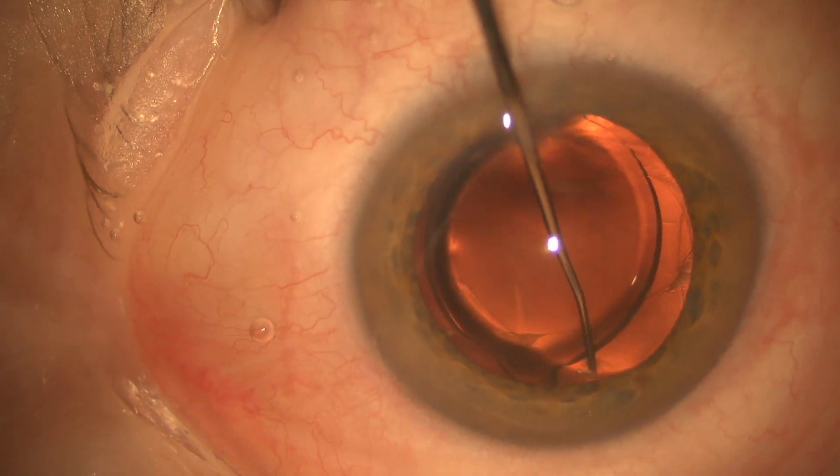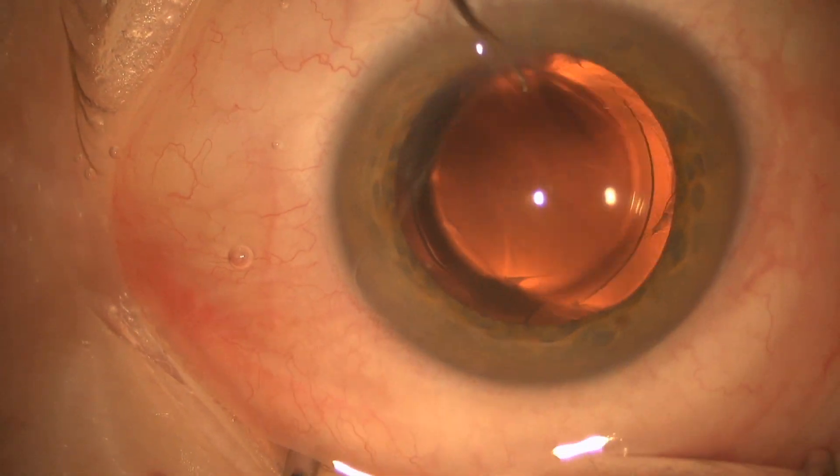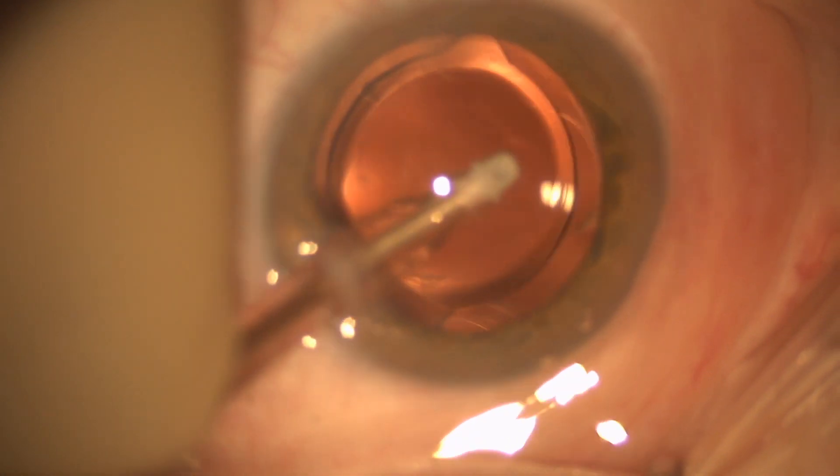Here you can see that we basically have the lens where we want it — it's very well centered and it's in the bag. I've inspected the posterior capsule and it's still completely intact, so now I'm going to remove the viscoelastic.